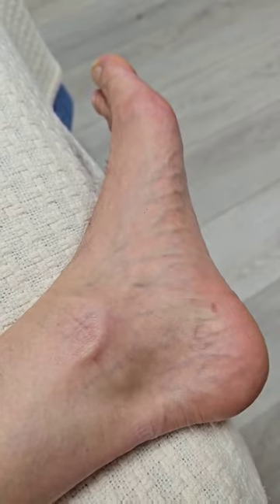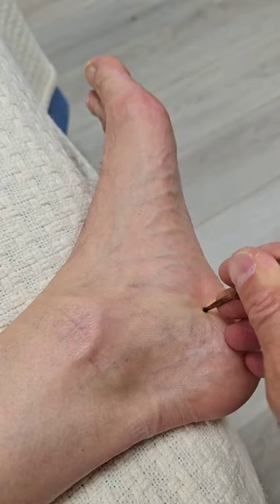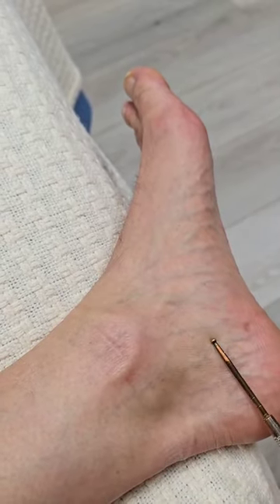Now quadratus plantae can refer pain into there as well, so in that position you can fan up a little bit towards the bone as well. You can fan forward, you can fan a little bit inferior, so you can move that needle around. Just need to pay attention to neural structures.